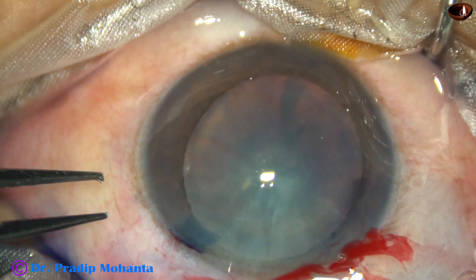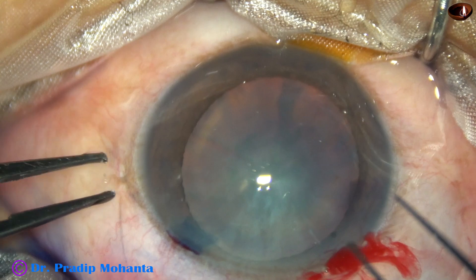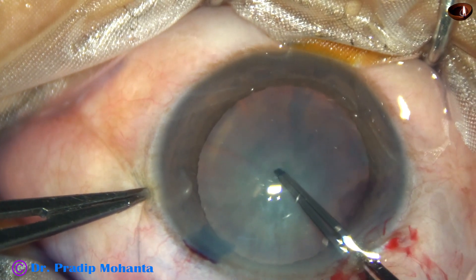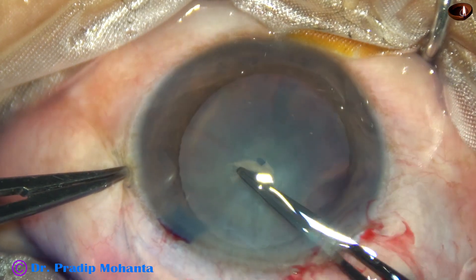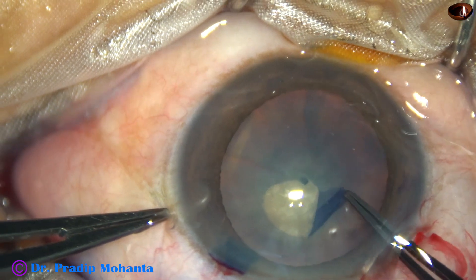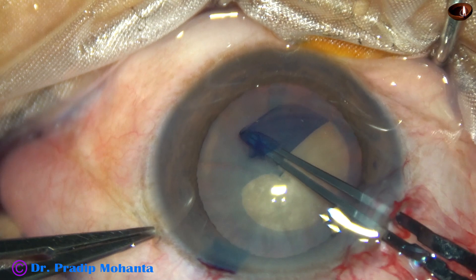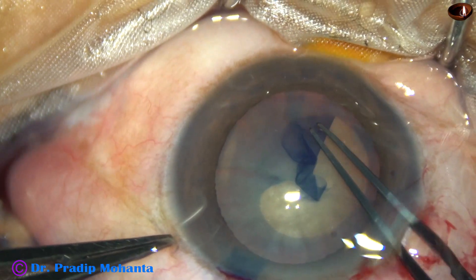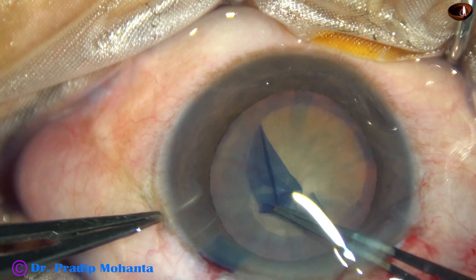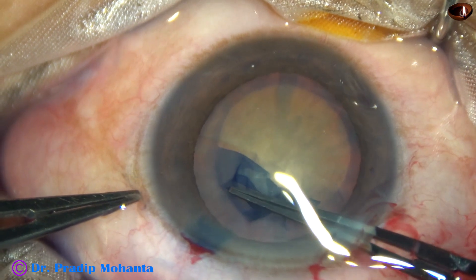Capsulorhexis is to be done. A utrata forceps is being used. The anterior capsule is punctured and a capsular tag is raised. The capsular tag is held with the utrata, and with an anti-clockwise movement, an adequate-sized continuous curvilinear capsulorhexis is performed.